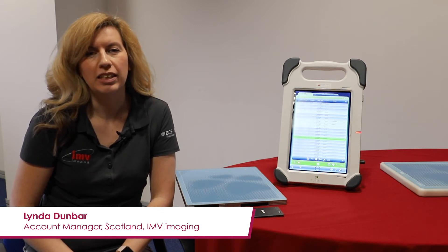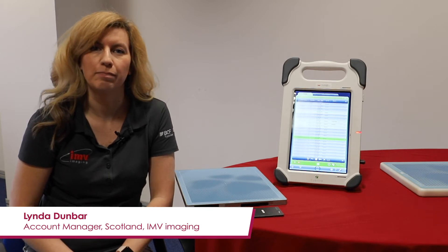Hi, I'm Linda, an account manager from IMV Imaging. Today I'm going to take you through a short video series on the basic functions of the Slate X-ray system.